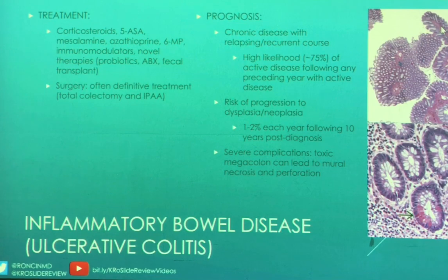This top picture is showing you filiform polyps, so remember these are old pseudopolyps. And this is showing you some more of that Paneth cell metaplasia, just to kind of tune your eye into that. Okay?